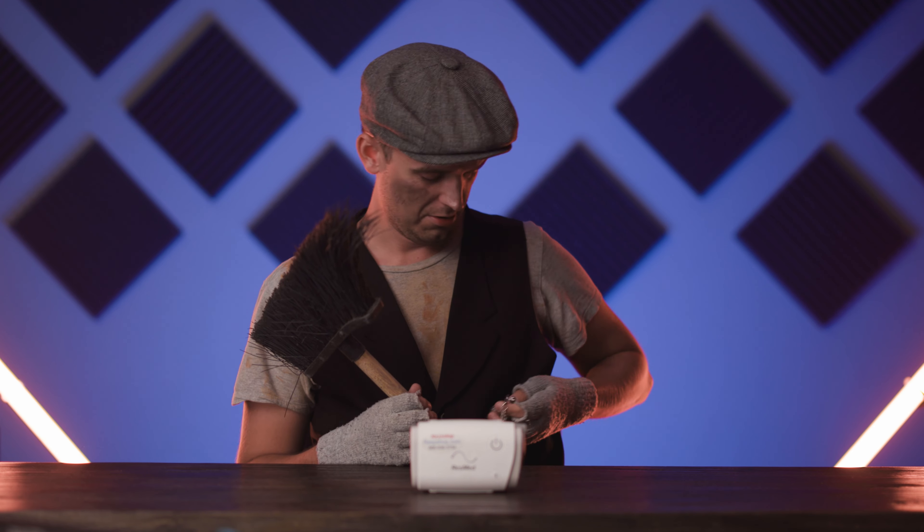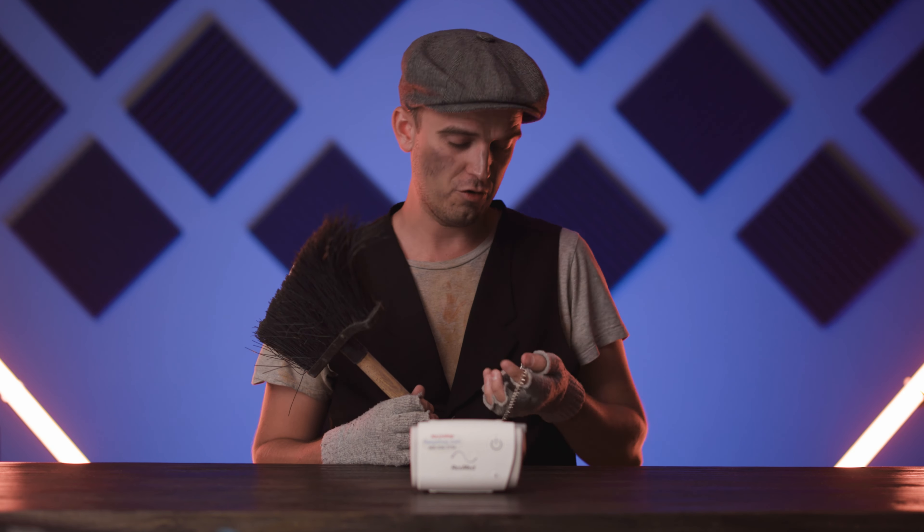ResMed AirMini is so popular, it must be some kind of Mary Poppins CPAP — practically perfect in every way. You guys are a heck of a crowd.